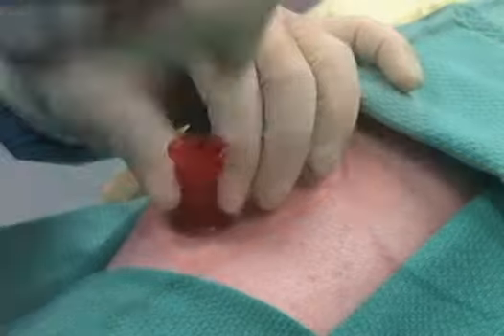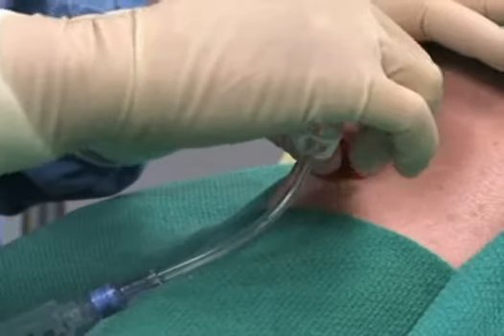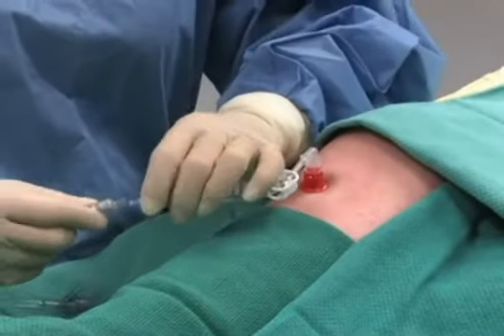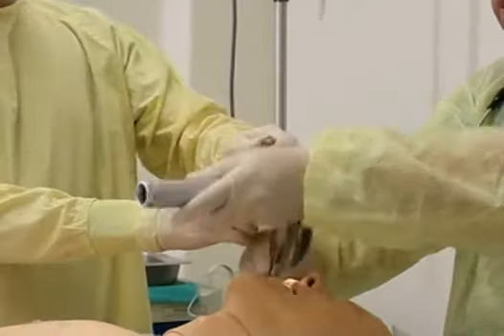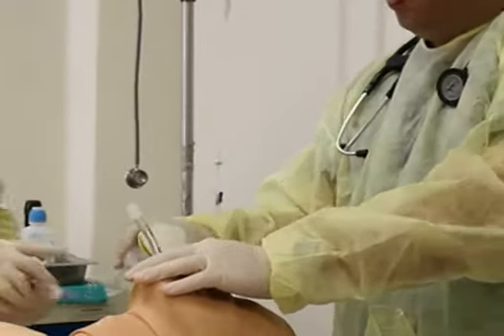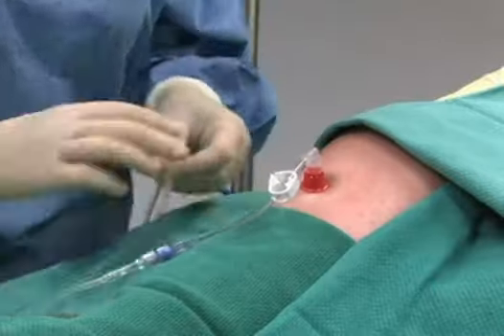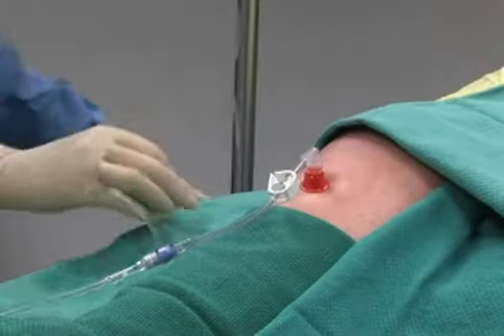in adults, especially since the advent of mechanical insertion devices. The most recent guidelines from the Advanced Cardiac Life Support Certification Institute, published in 2010, recommend the intraosseous route over the endotracheal route for the administration of fluids and medications in adult patients in whom intravascular access is not available.